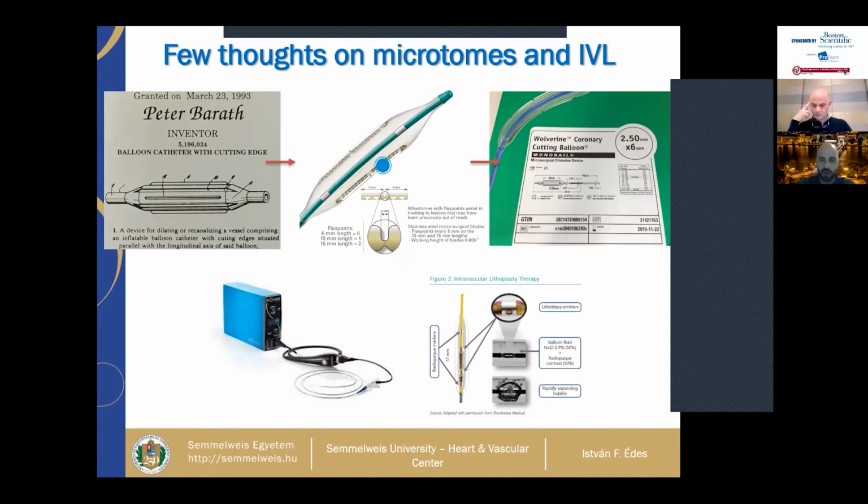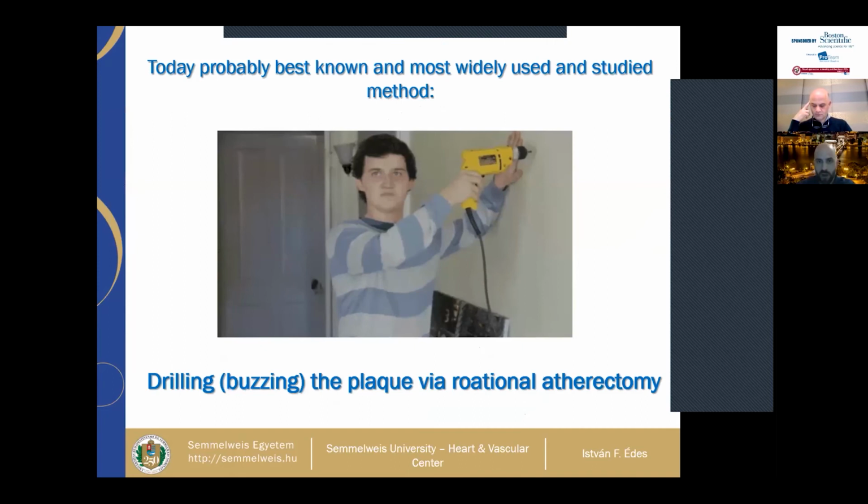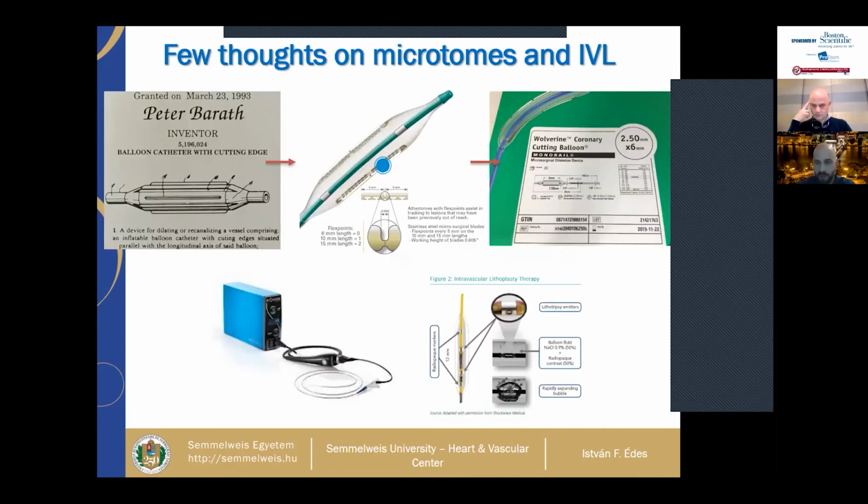We've also heard from Dr. Meana about the IVL, the intravascular lithoplasty system. I don't want to say everything again. It's a system with lithotripsy emitters in which a balloon is expanded and the fluid inside is pulsed via the sound effect, and it creates a rapidly expanding bubble which cracks calcium.